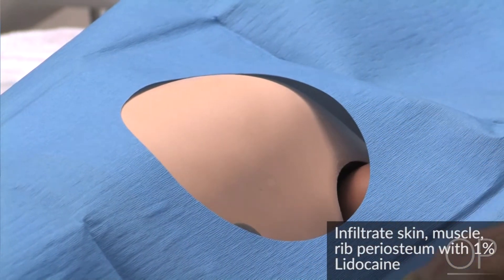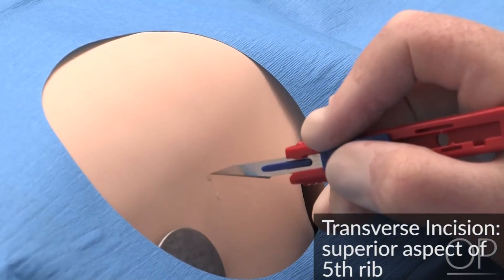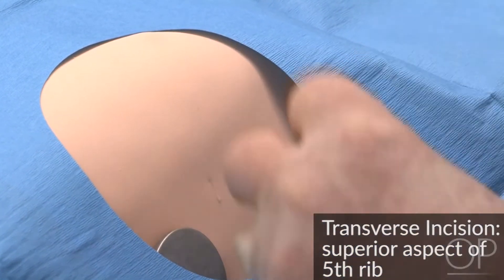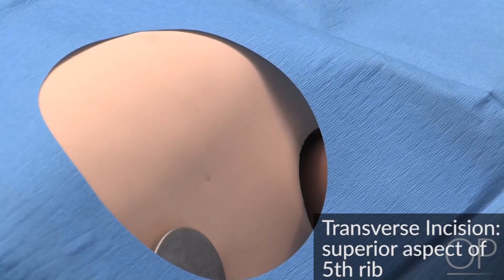Aspirate during insertion to be sure you are not in a blood vessel. Make a small transverse incision, 0.5 cm, over the superior aspect of the 5th rib.